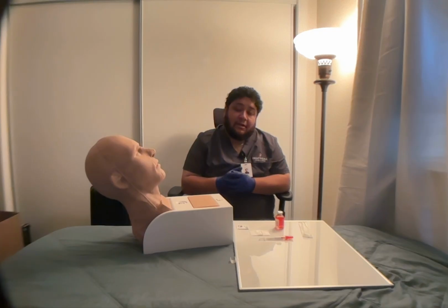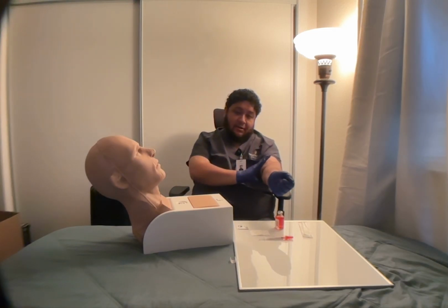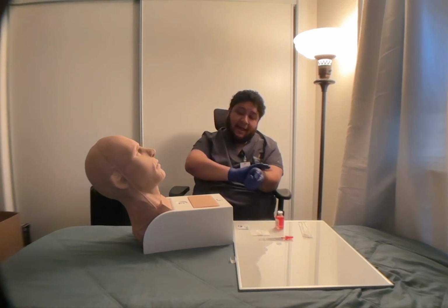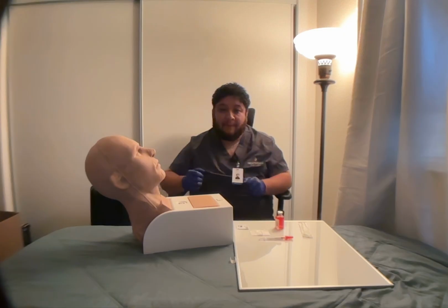Now what I'm going to do is go ahead and select the site where I'm going to inject. So it's recommended that you do 4 fingers below the antecubital space and 1 hand space width above the wrist. Okay? So the preferred area is here, which in this case is my prop.